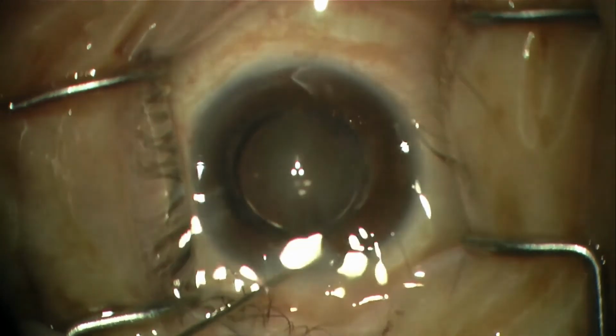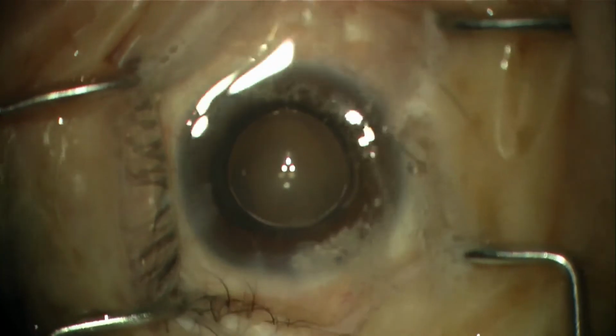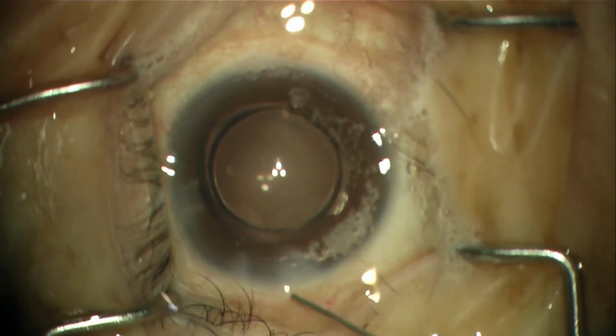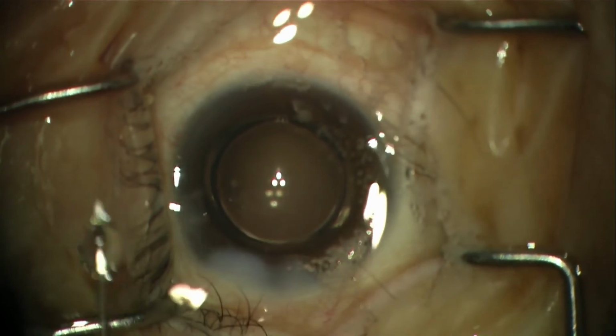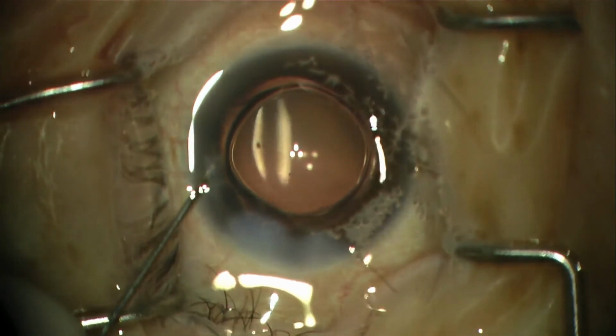And our job now is to hydrate the incisions. And here we're using balanced salt solution to hydrate the incisions and reform the anterior chamber. So we've hydrated the main incision, and now we'll be hydrating the paracentesis.